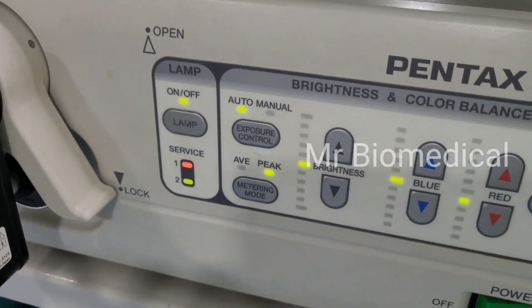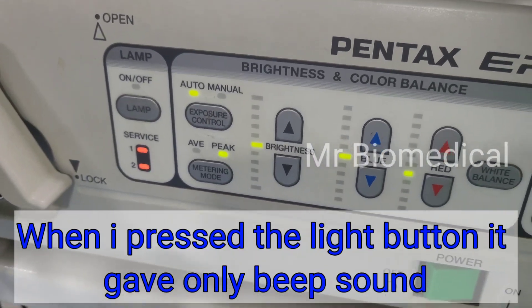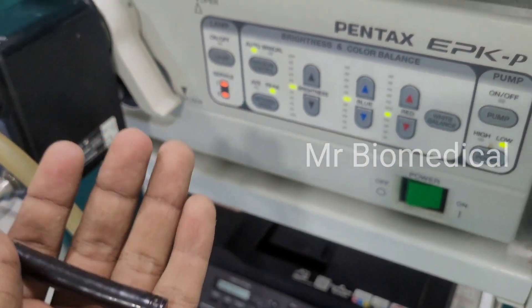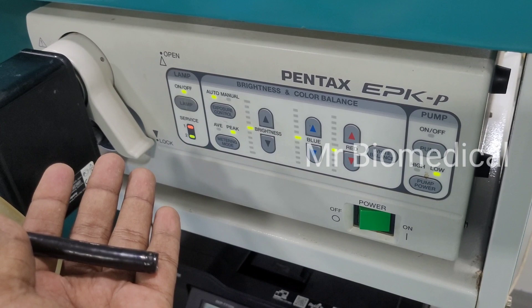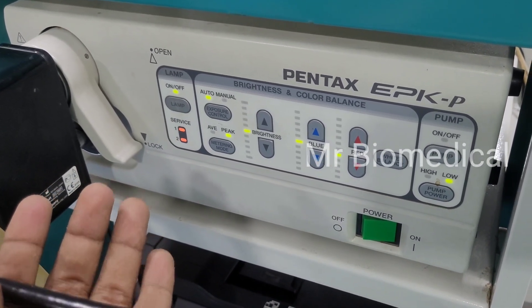In this video we are going to see about a Pentax endoscopy machine. When I press the light button, it gives only a beep sound and the light is not coming. Let's get started.